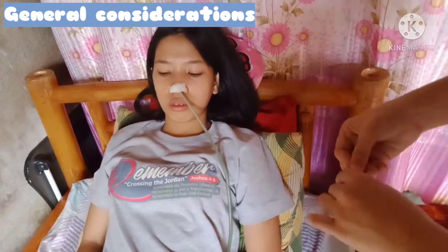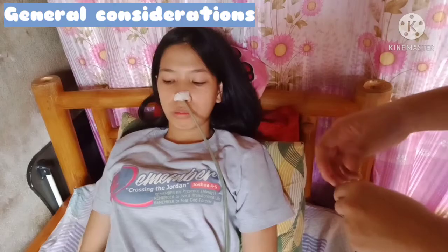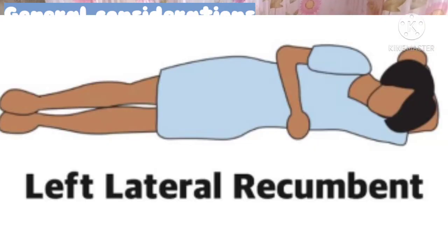And after that, we have to aspirate GI contents. If unable to aspirate GI contents during the first attempt, reposition the client to allow the tip of the tube to rest in the pool of GI contents, flush the tube with an additional 30 ml of air, and attempt to aspirate.